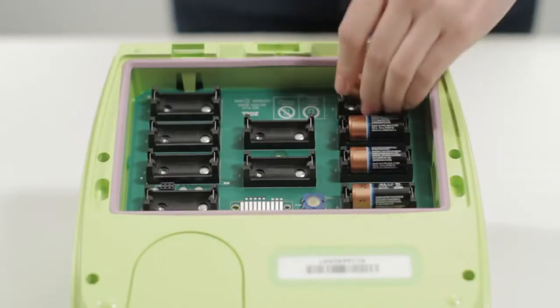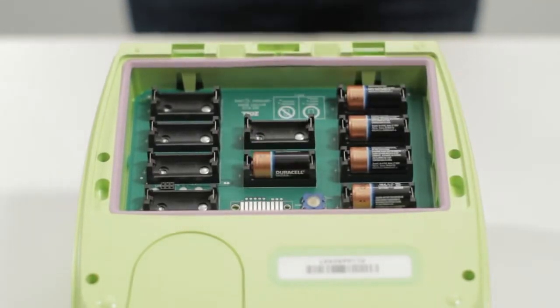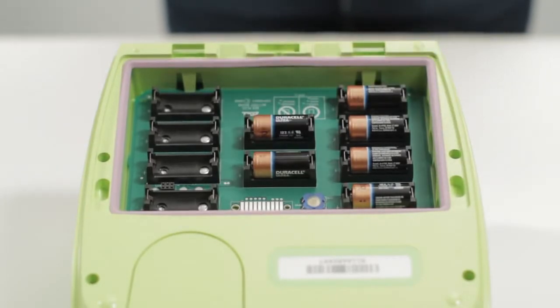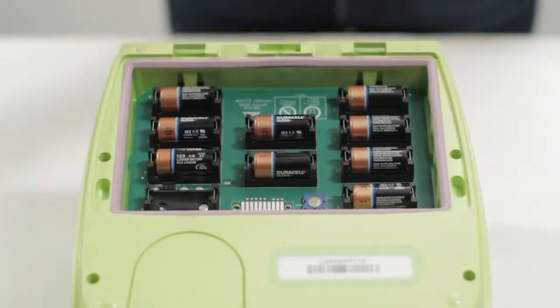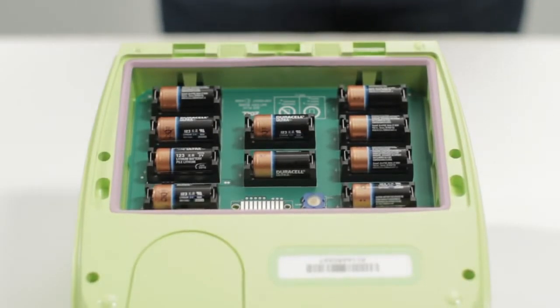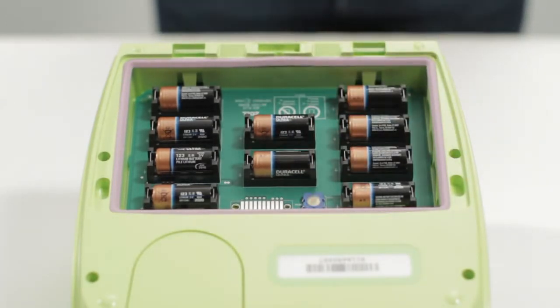Insert the batteries into the 10 battery brackets. Be sure that the positive and negative end of each battery is aligned correctly, as indicated on the battery bracket. While inserting the batteries, the AED will tell you, "Install batteries." And when you complete the installation, the AED will tell you, "If new batteries, press button." When you push the button inside the battery compartment, the AED will react immediately, telling you to plug in the electrode pad cable. "Plug in cable."